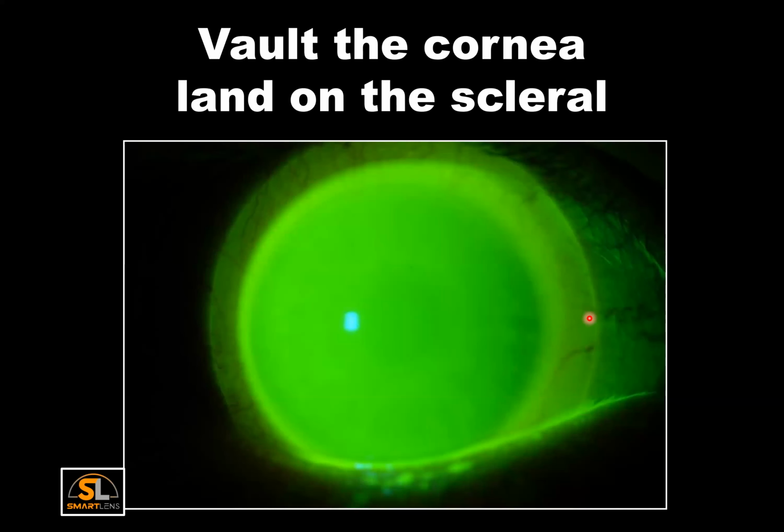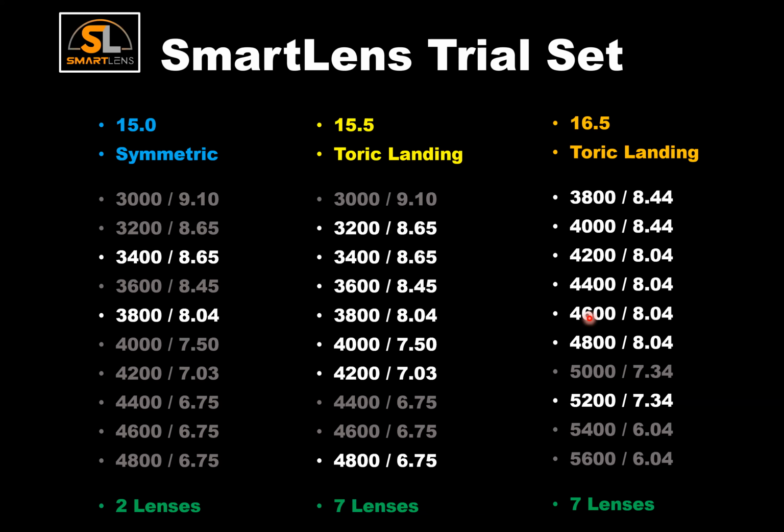Now the SmartLens trial set comes in 3 different diameters, and this is to accommodate the wide range of cases that you might fit. You'll notice in the 15 millimeter diameter, there are 2 diagnostic lenses. And the reason for that is it's rare for us to need an incredibly small scleral lens.